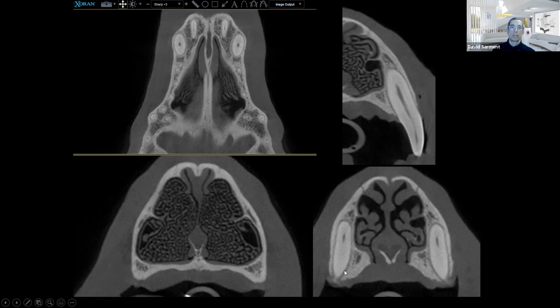And actually, I've seen this a lot where you see a ligament wider in one spot, narrow in another spot, and you can almost infer the pressures and the movements that are being put on these teeth just by looking at the thickness of the periodontal ligament.